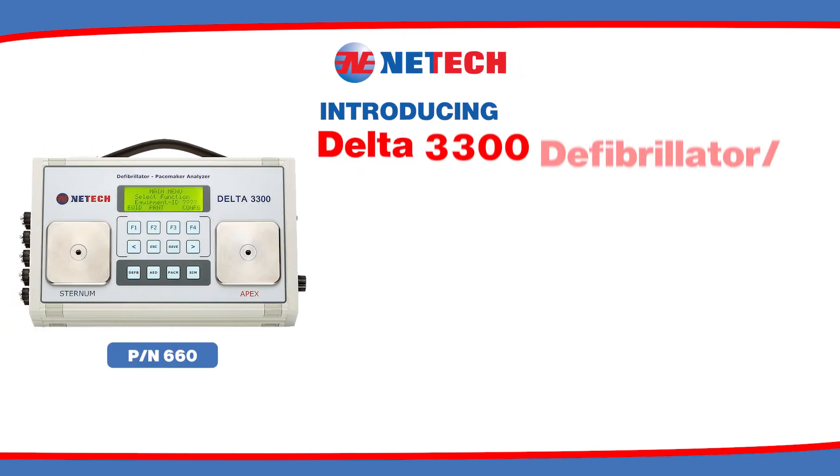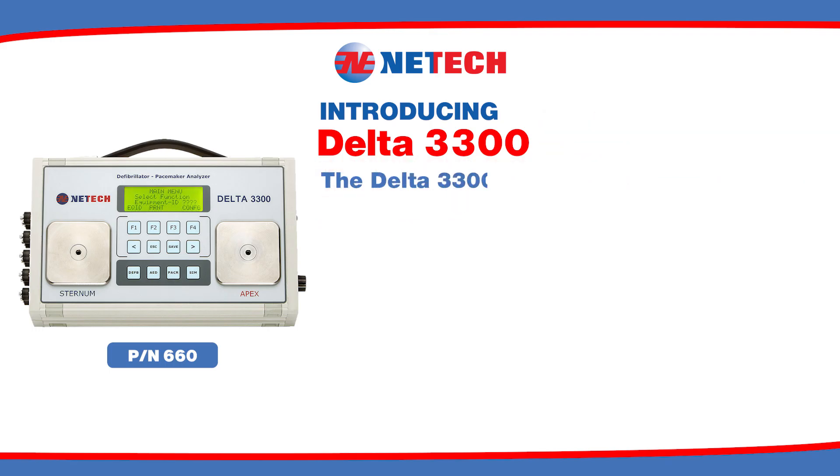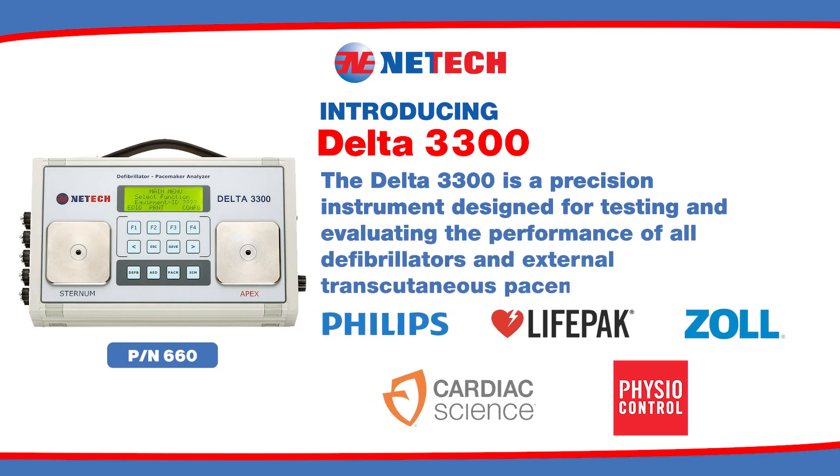Introducing the NetTech Biomedical Delta 3300 Defibrillator Transcutaneous Pacemaker Analyzer. The Delta 3300 is a precision instrument designed for testing and evaluating the performance of all defibrillators and external transcutaneous pacemakers.